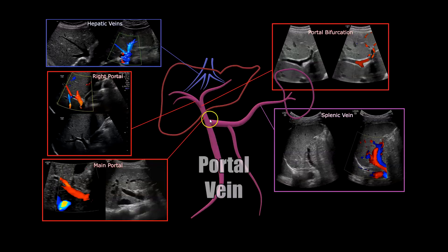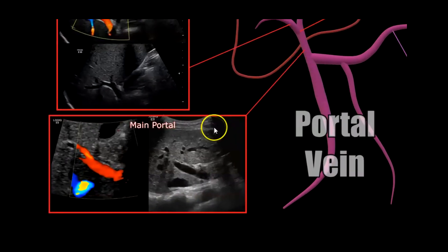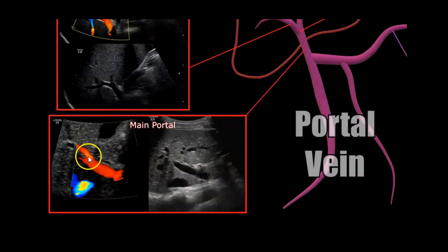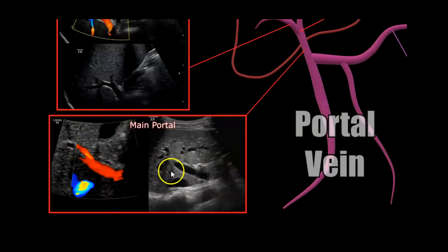So the main portal vein would be right here, and then you have your corresponding ultrasound image. Here's your grayscale image of the main portal vein, and then color Doppler. You can see the blood flow is going towards the liver, which is normal — hepatopetal.